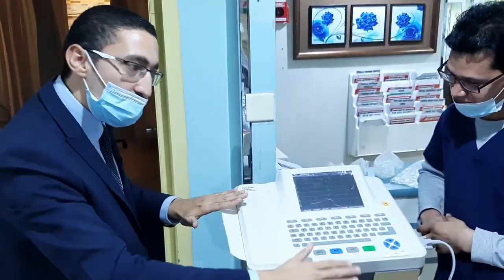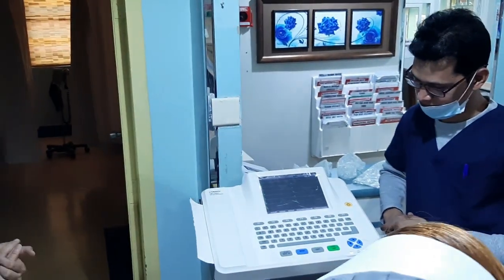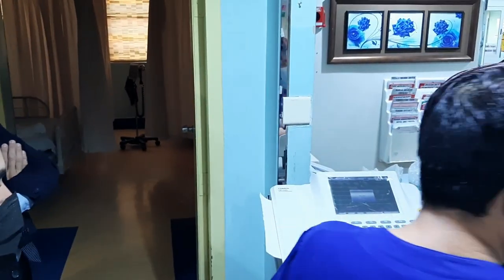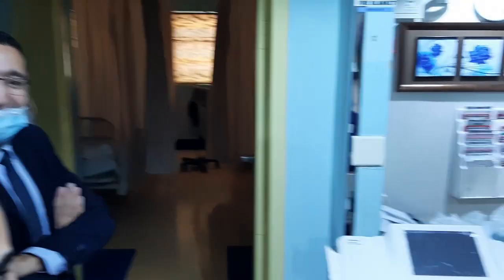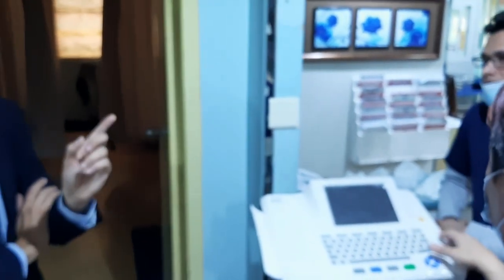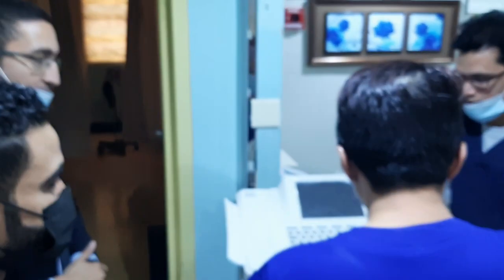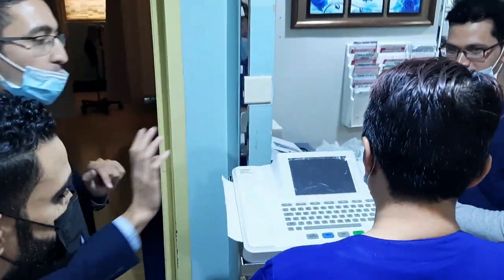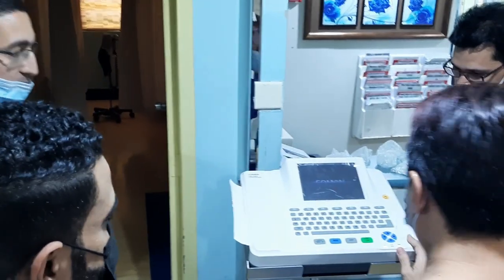So if you want to try now, by volunteer. Better to try on an actual patient. Do you have a patient for ECG? Start. So, is the machine off? Now it's already off. Don't just press, long press until you hear the sound. Until you hear the sound, it will come.